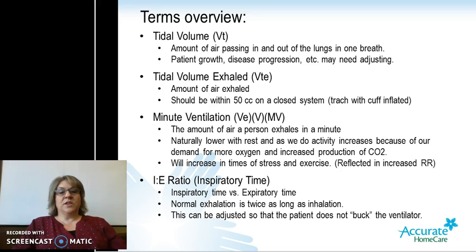IE ratio, or inspiratory time. It's inspiratory time versus expiratory time. How long do we have to inhale versus how long do we have to exhale? Exhalation is typically twice as long as inhalation. This number can be adjusted so that the patient does not buck or fight with the ventilator. This can be done by contacting your DME company and telling the respiratory therapist what your concerns are. They will come and evaluate your patient and see if any adjustments need to be made.